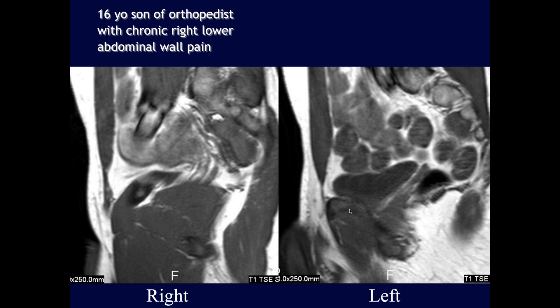A 16-year-old tennis player — son of an orthopedist — with chronic right lower abdominal pain. The distal rectus abdominis tendon appears attenuated and markedly thickened on the right compared to the normal left side, similar to how medial collateral ligament injuries show thickening. This is evidence of chronic injury from tennis. The rectus abdominis muscle also shows some atrophy on the injured side.